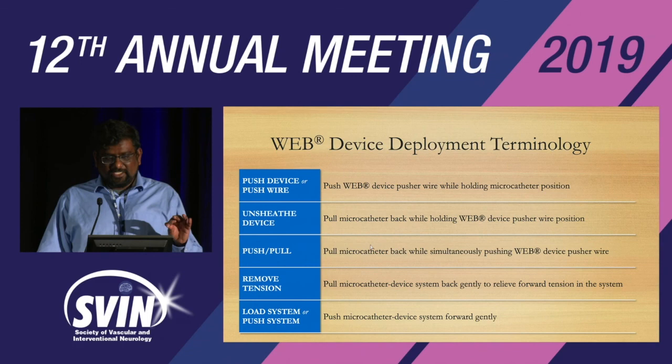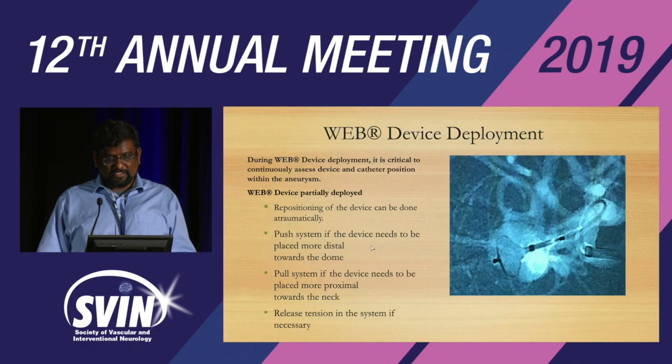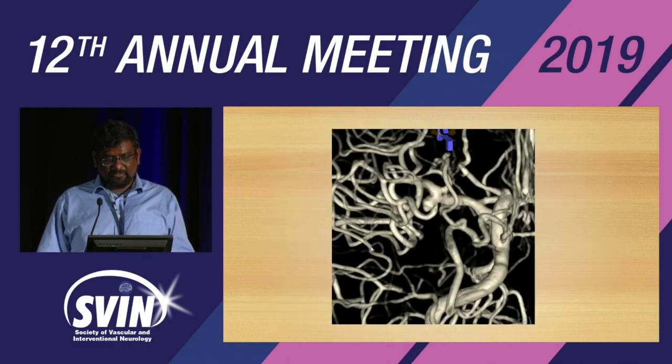It may not fully detach. Then you have to advance the microcatheter gently to detach it. So here are the imaging cases we talked about. We'll go through that quickly.